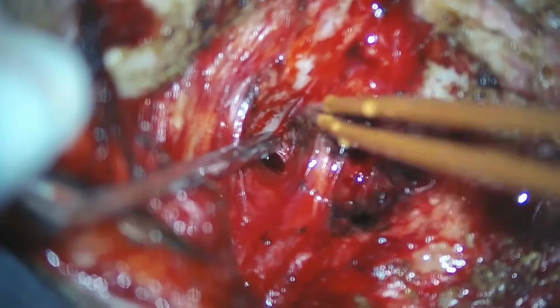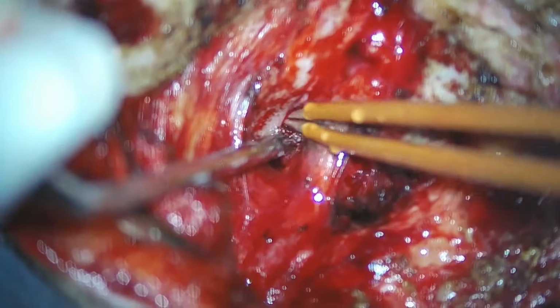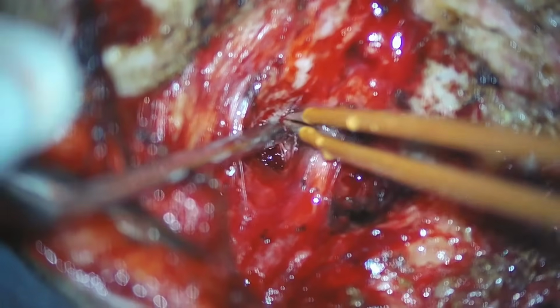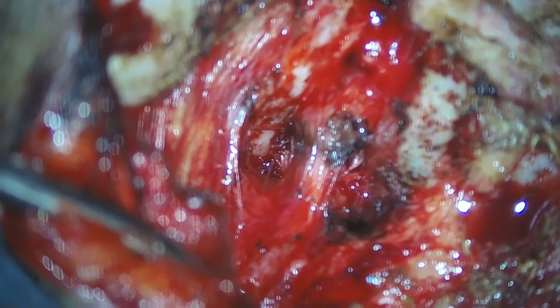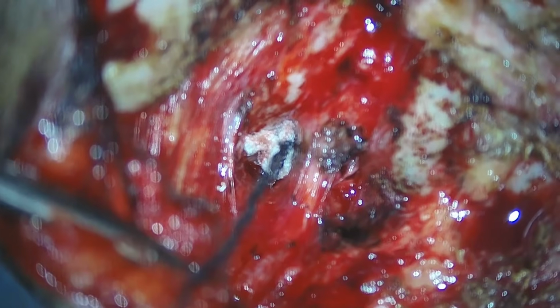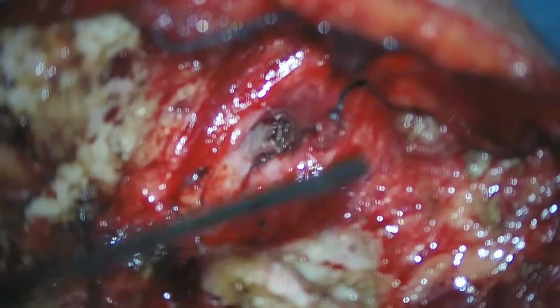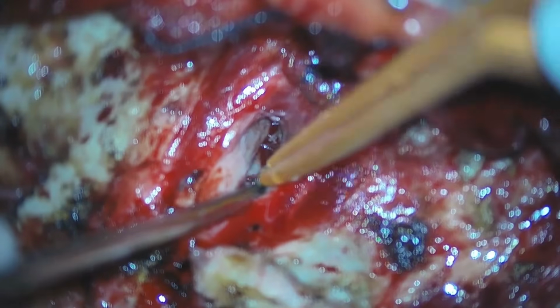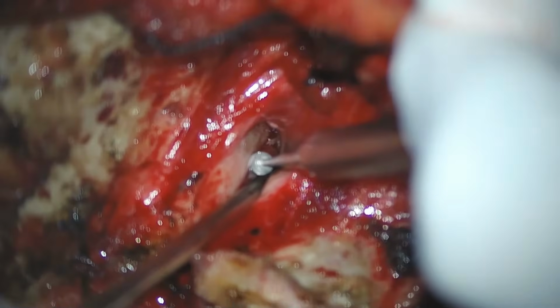Again we can see there is oozing from the venous plexus around the C2 ganglia, which are slowly packed with gel surgical sheet and with cotton. And we again switch to the right side. Here we can see the attachment between the lateral mass and the C1 posterior arch.